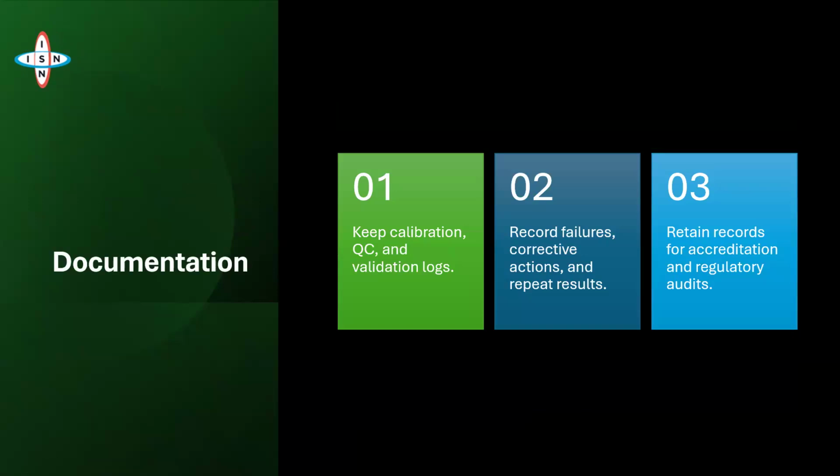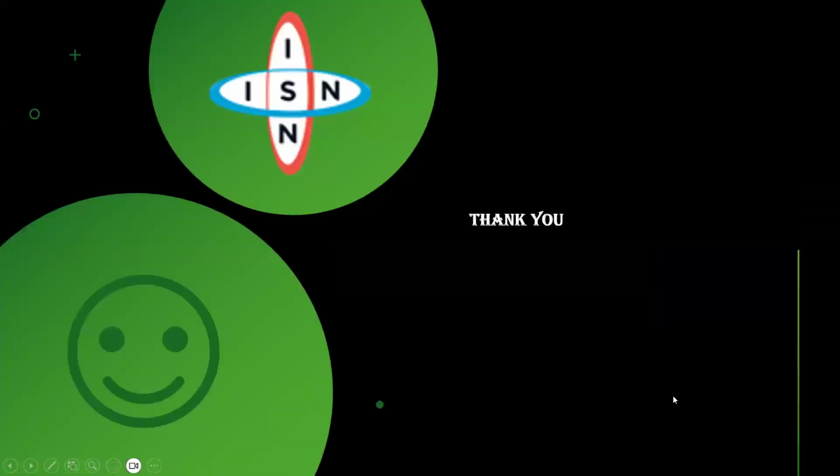If a validation or calibration or quality control fails. And we also advise you retain records for accreditation and regulation audits. So thank you very much.